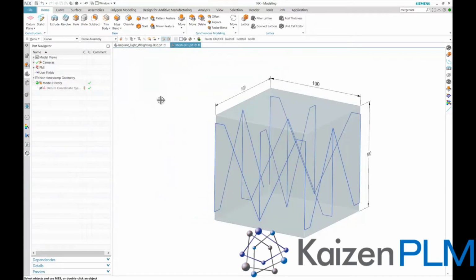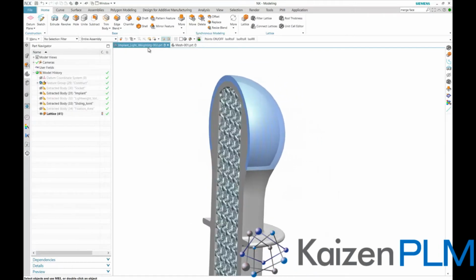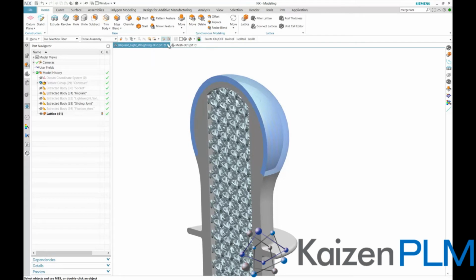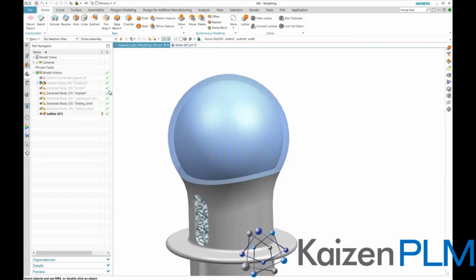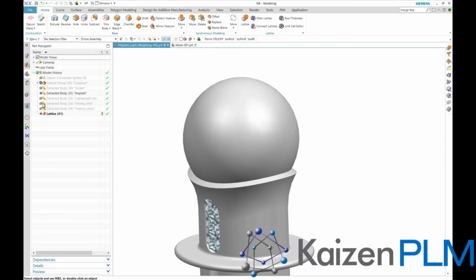With the custom lattice unit cell defined, we return to the implant to actually add it as a lattice to the ball of the implant. Hiding the polymeric layer of the ball, that is to be fixated to the lattice, exposes the ball surface to use as base for the mesh fixating the polymeric layer to the ball.